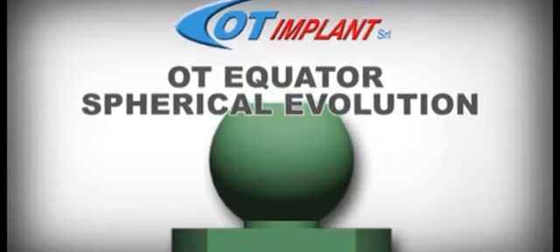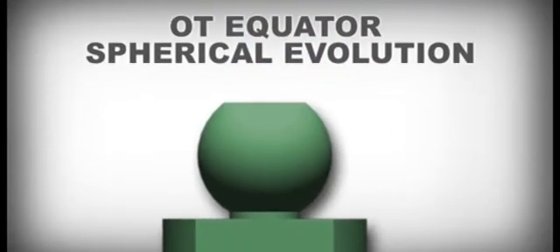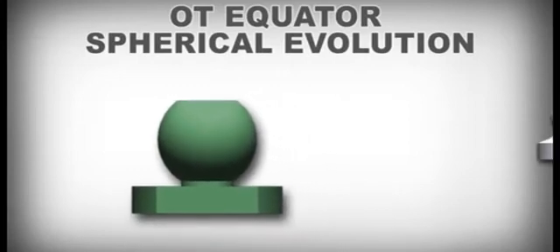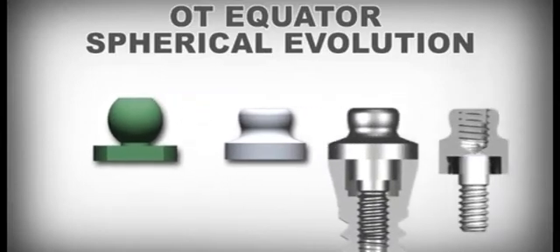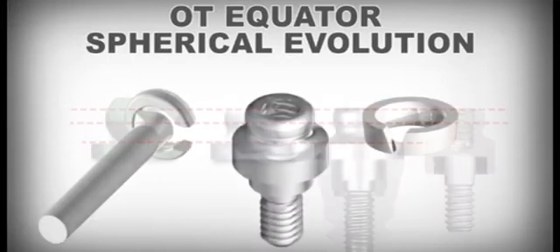OT Equator Spherical Evolution. Starting from the OT cap sphere, where the top part of the sphere was already missing, the head was further lowered in this project to retain only the part of the equator. Hence the attachment's name, OT Equator Biologic, where the divergence is used as retention using the Seeger spring.